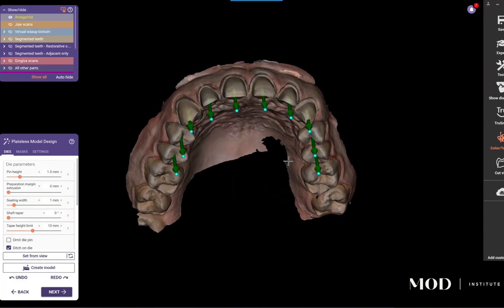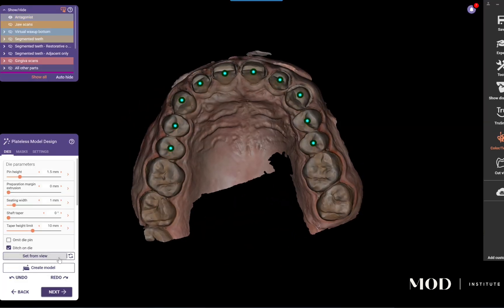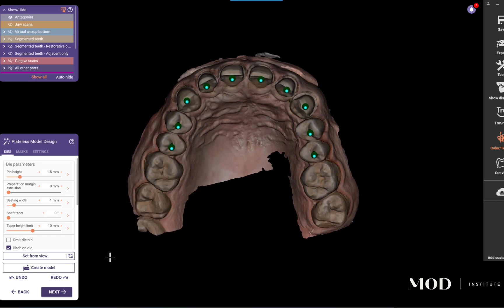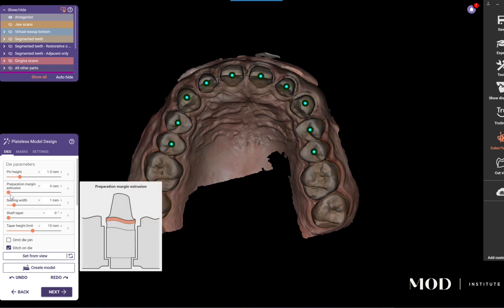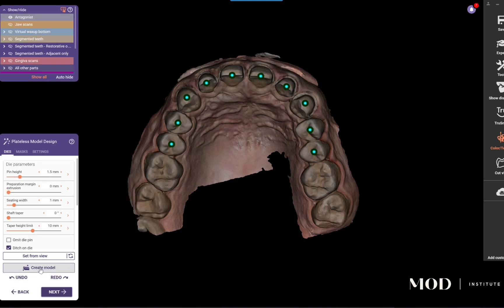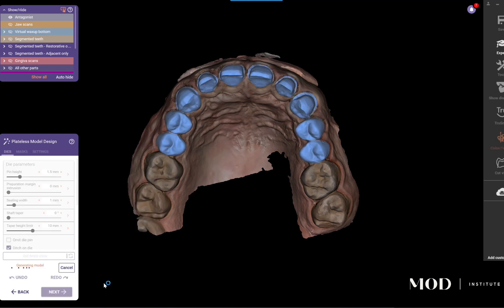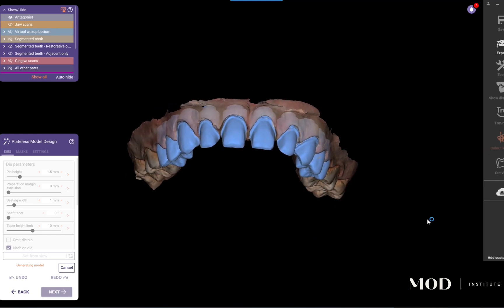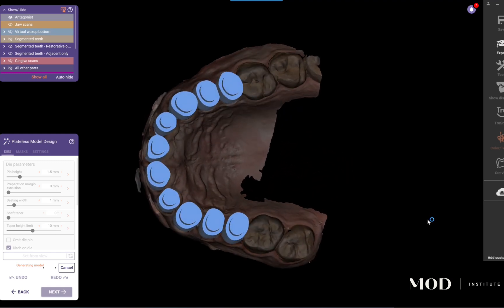Now you pick the path of insertion of those dies. I'm going to hit 'set from view' from more of an incisal edge-down position. You can also select the die parameters like spacer and all the normal die controls available in ExoCAD.